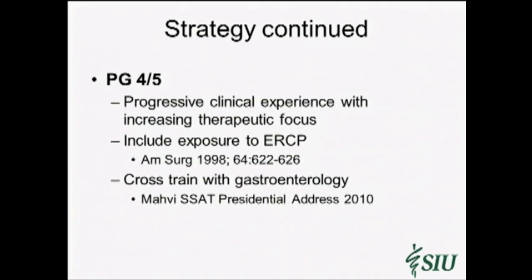Most of our residents won't do ERCP. I think it's typically something they're going to have to do a fellowship to do. But Dave Shears and one of our other colleagues and I did a study years ago that showed that you could immediately involve residents in ERCP, even letting them do much of the procedure, and the outcomes could be similar to cases in which there was no resident involvement.